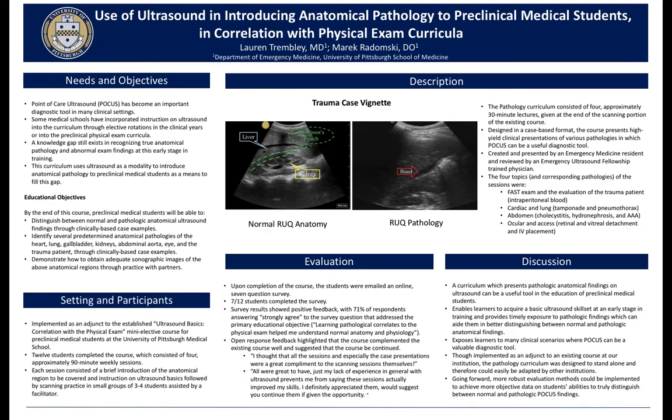What typically happens in ultrasound training is that students practice their ultrasound skills by either scanning themselves or by scanning standardized patients. In doing so, they are likely exposed to a myriad of normal findings and variations of normal findings and become really adept at identifying them. However, without being exposed to any abnormal or pathologic findings, it can become confusing for the learners in distinguishing between normal and pathological findings.